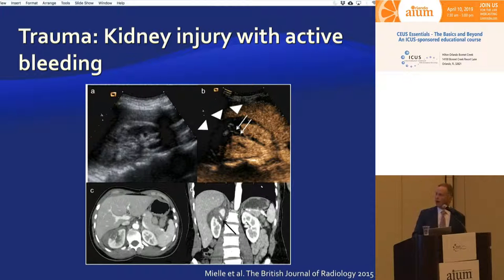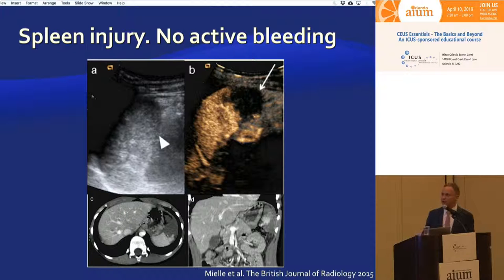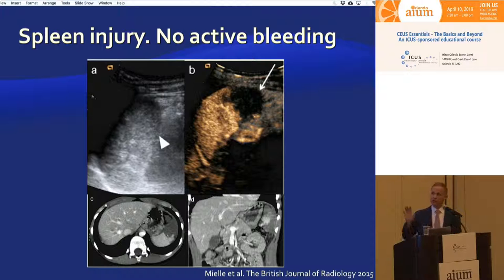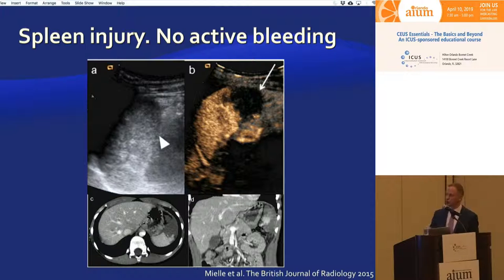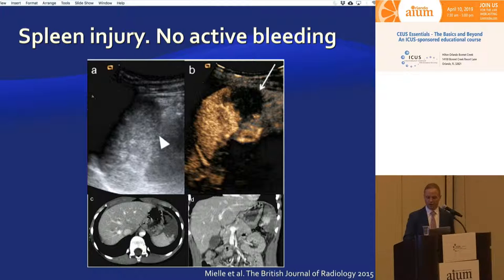For a renal laceration with a large area of extravasating contrast, you can see contrast corking out of the lacerated kidney — very similar to findings on CT. For splenic injury, contrast-enhanced ultrasound is very helpful days after injury to confirm there is no active extravasation. If pressures and hemoglobin are dropping, the question of recurrent splenic bleed or rupture can be definitively answered. A nicely enhancing spleen with a large area of decreased perfusion indicating splenic infarct and no active extravasation means there is no reason to do CT or embolize.